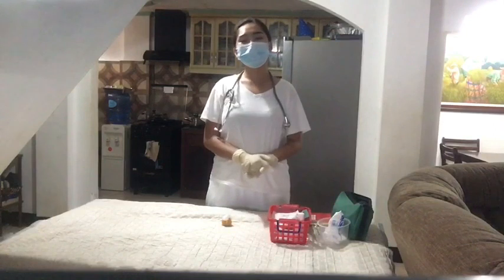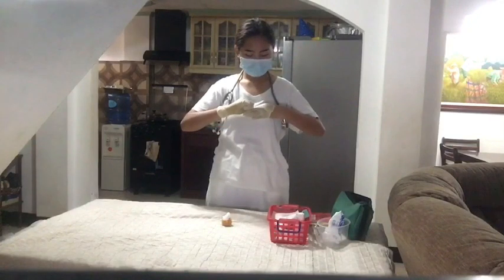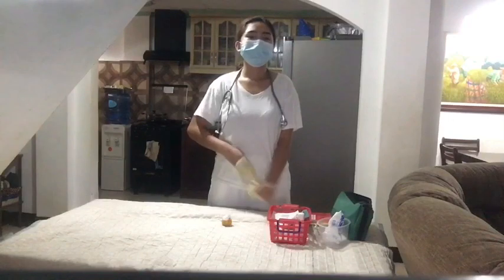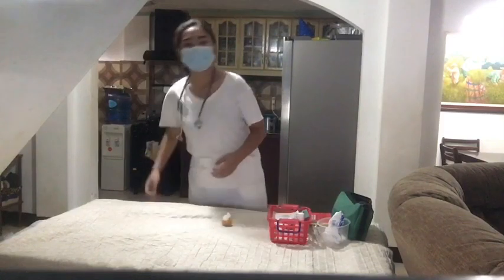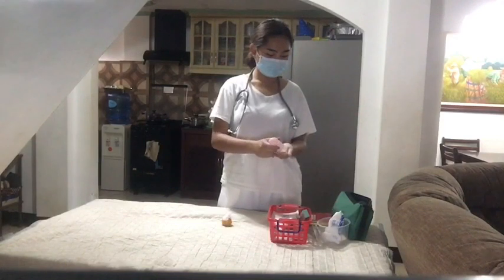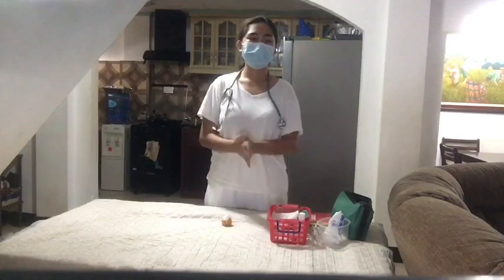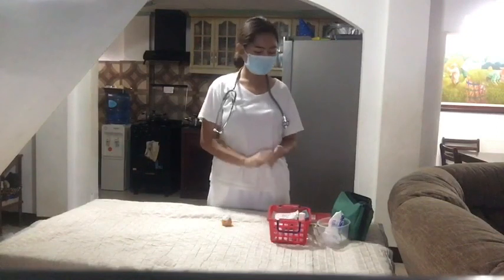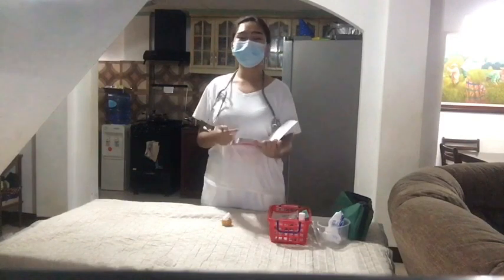And we will now remove gloves and wash hands. This is to prevent the spread of infection. And the last step is to document all relevant information. Documentation provides coordination of care.